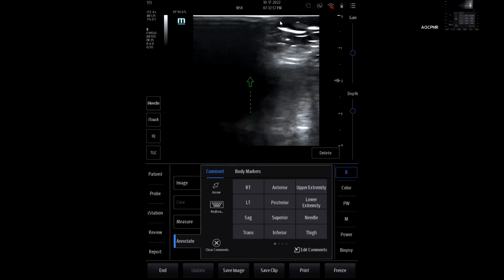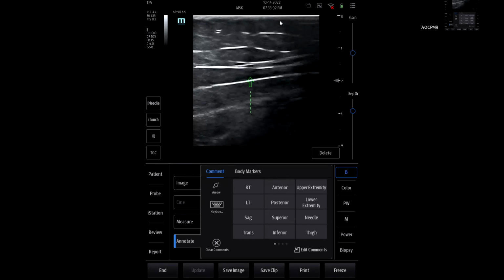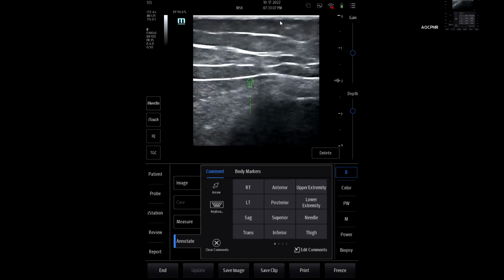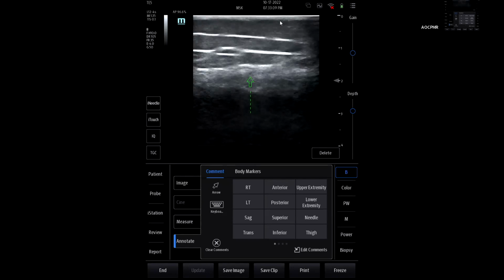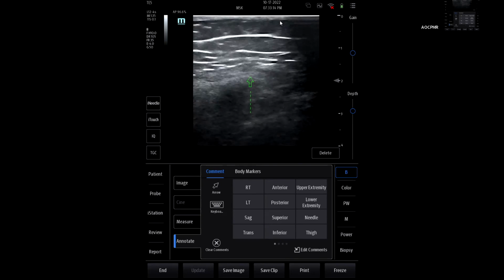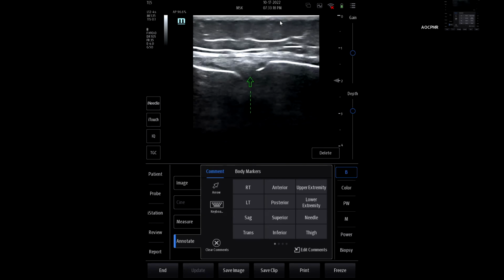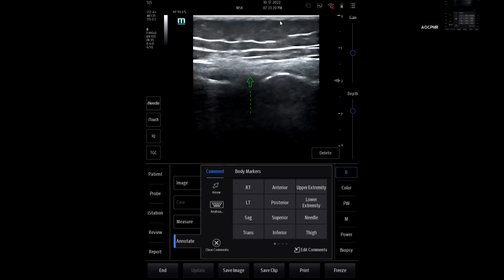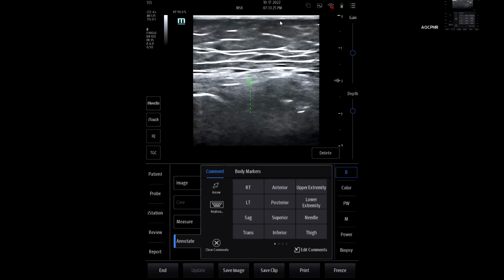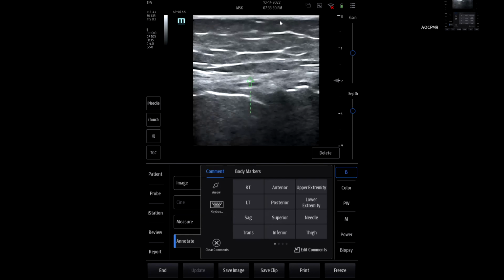So that's anterior evaluation. Let's move to our medial. I'm going to try and find that joint line. Let's get some more gel. So this is all femur, travel south, inferior, inferior, inferior. And here we go, there's our joint line right at that arrow right here. Now, if I move a little bit more posteriorly, I should be able to find that MCL a little bit more clearly.